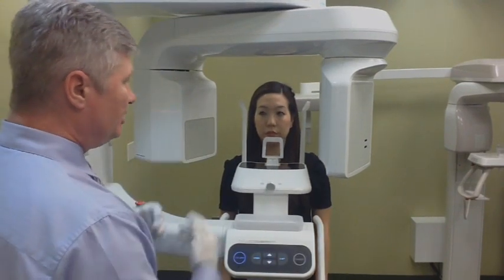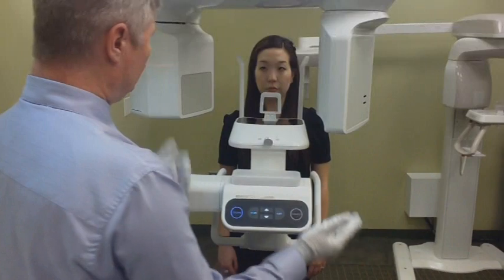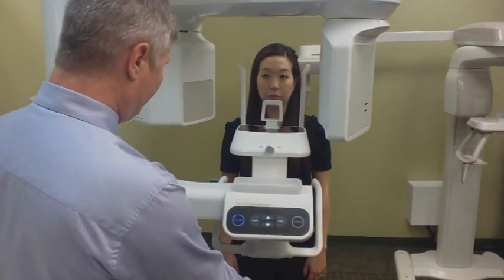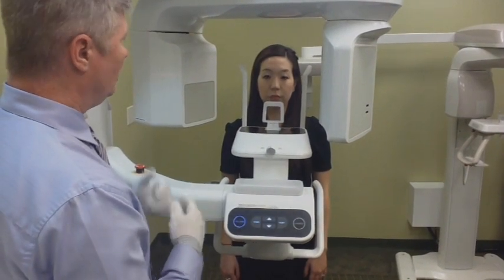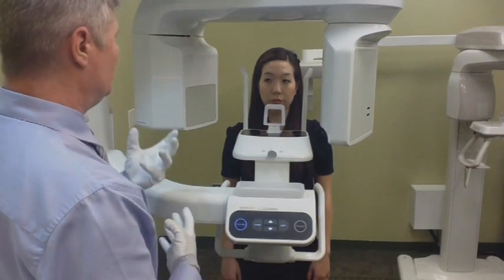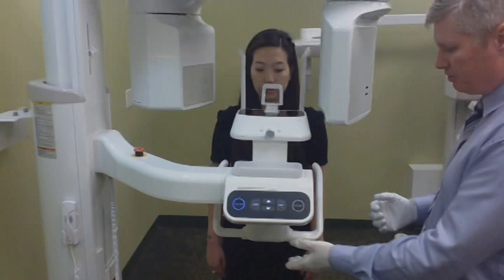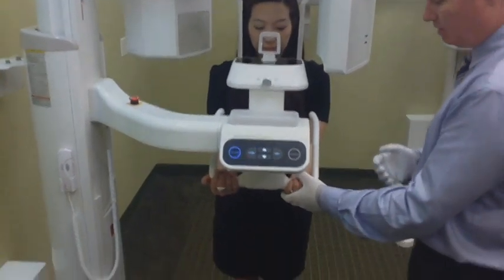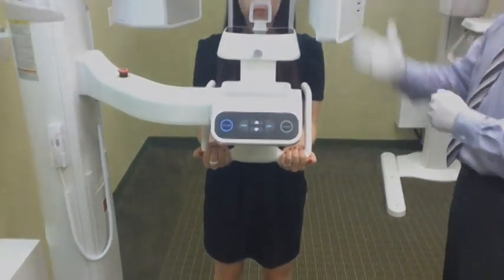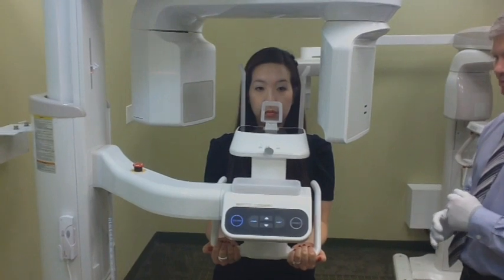Patient positioning for TMJ is very similar to a panorama image. When the patient comes into the device, have them place their hands on the bottom of the bar, palms facing up towards the ceiling, with elbows tucked in towards the body to reduce lateral movement. Have them place their feet forward about an inch, shoulder width apart. Then have them place the base of their nose on the horizontal ridge. Lower the machine so the horizontal ridge is in line with the base of the patient's nose, then help the patient come forward and press the base of the nose onto the appliance. Ensure the patient's jaw is free and not touching any part of the device.